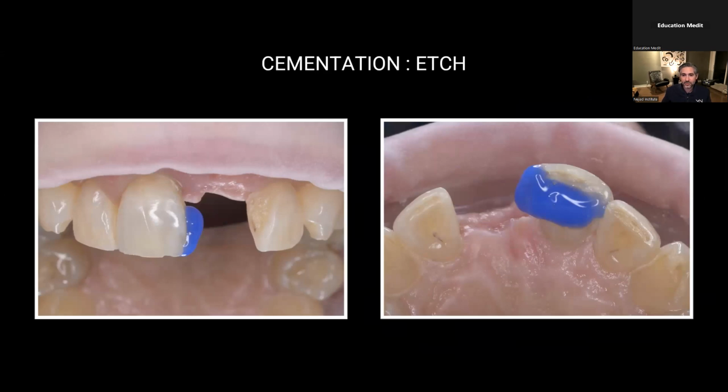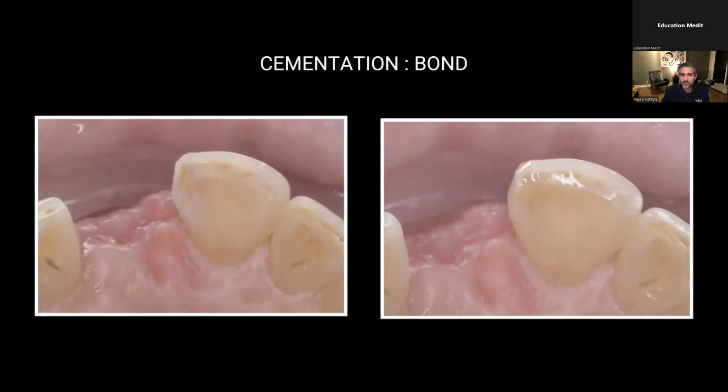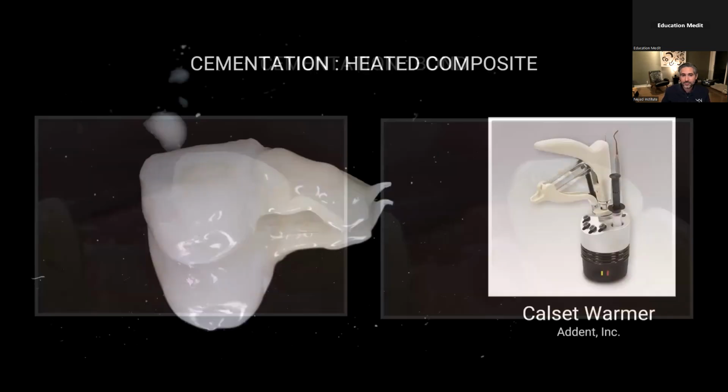Okay, so I'm etching the areas where I need the wing or the connector to be, and making sure you notice to go interproximal here, because I want this surface area for adhesion. So we got this frosty appearance of the enamel. The interproximal had an existing composite, so I sandblasted it ahead of time too. This is all going to be replaced in the next phase of treatment, so there's really no major concern.